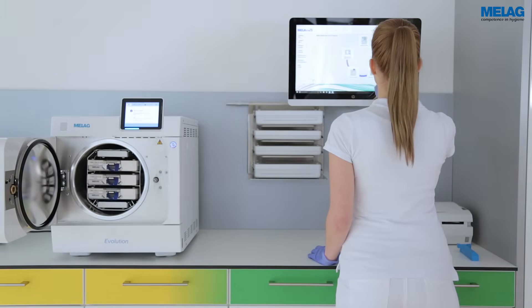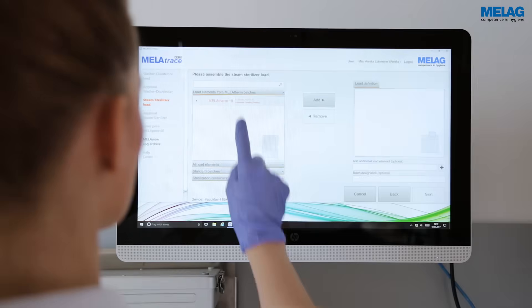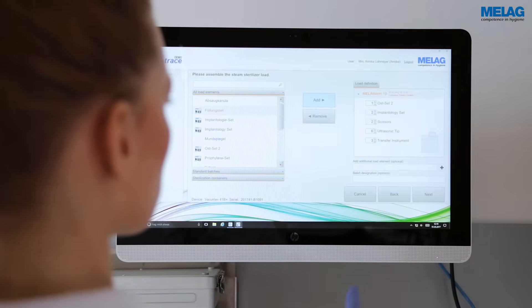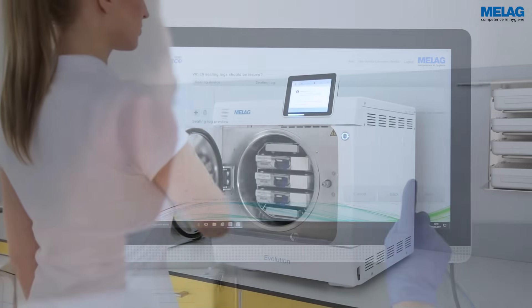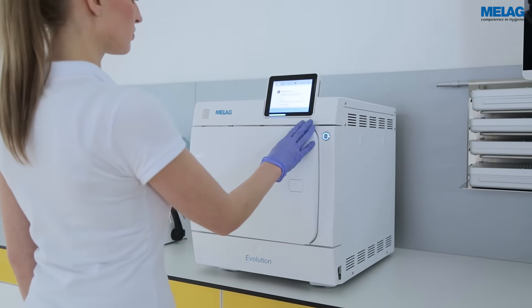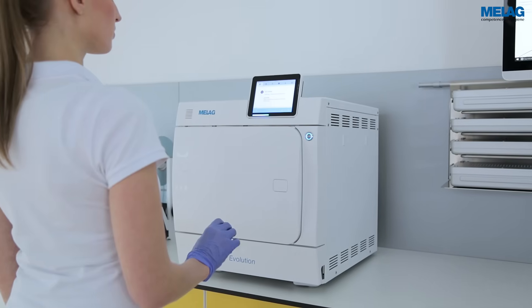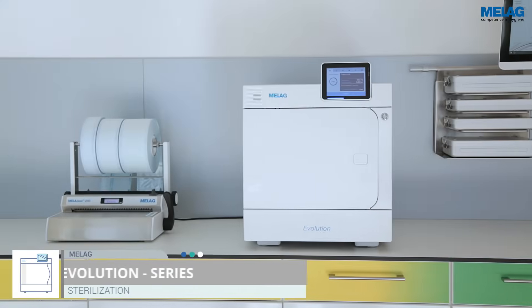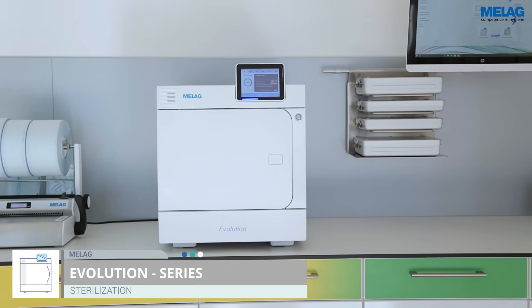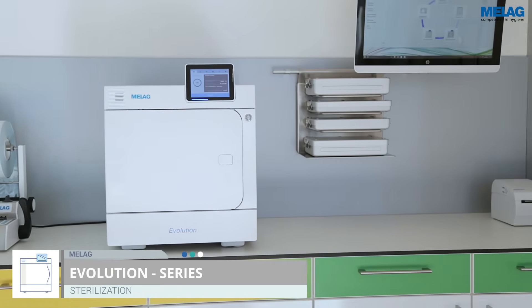Load management with MeLaTrace allows a simplified registration of the instruments for the sterilisation procedure. The intuitive user interface enables easy to use operation. The premium class Evolution Steam sterilisers combine intuitive operation, large loads and sterilisation in record time.